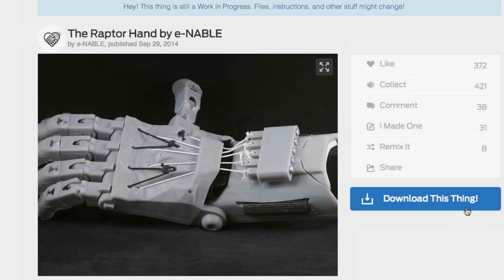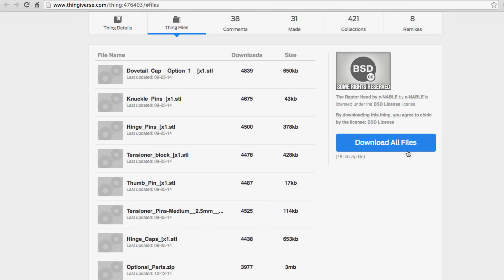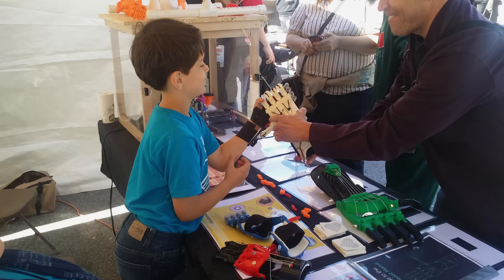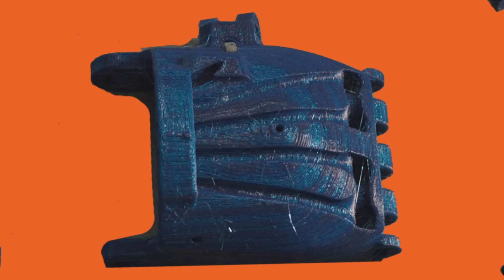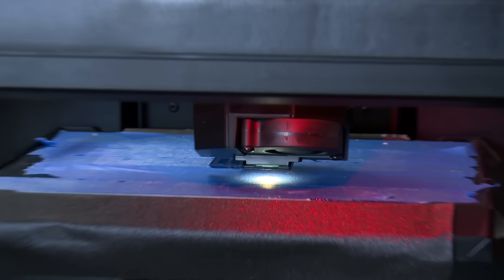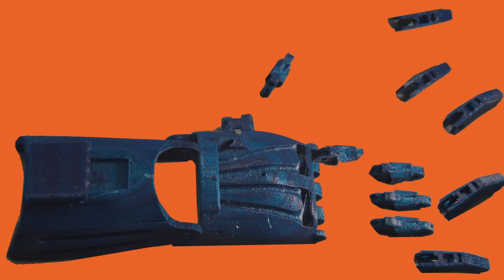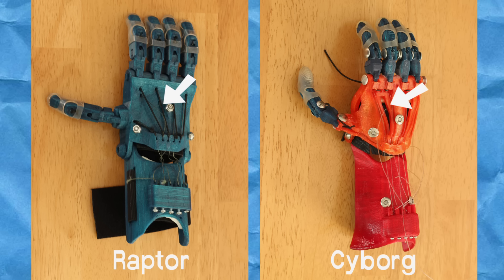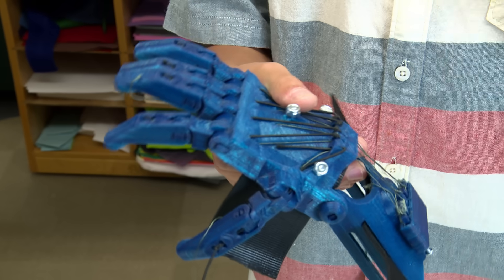I've already done a lot of work on the Raptor. First, I went to the e-NABLE website and downloaded all the individual files. e-NABLE is a group of people from all over the world who use engineering and 3D printing to make fingers and hands. Altogether, the pieces and hardware came to about $35. Then, after I printed them all, I had to assemble the Raptor, and that took about 3 hours. With the Raptor, the cords don't have to bend over the top of the hand like they do with the Cyborg. This decreases friction and makes it a lot easier to bend the fingers down. The less friction, the easier the motion.